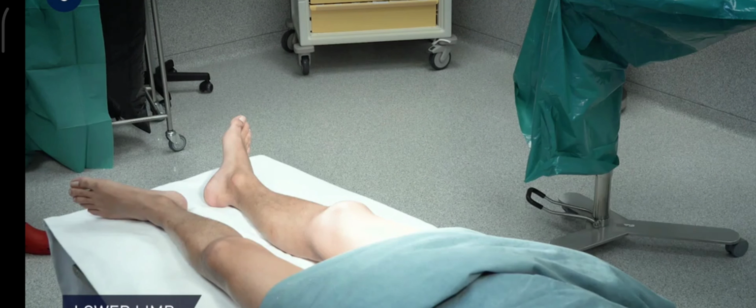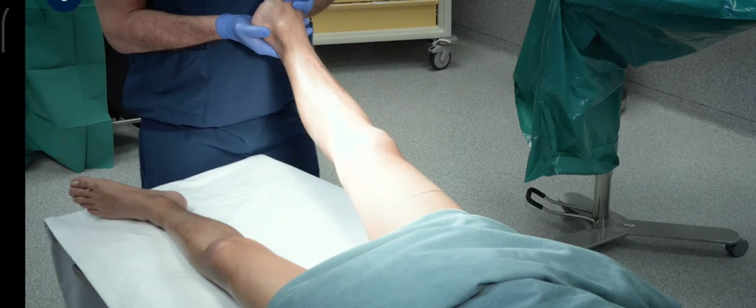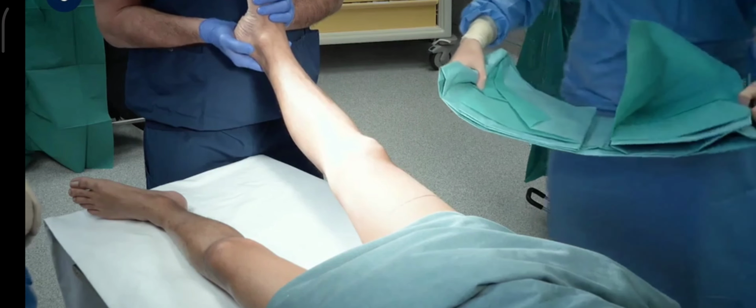Cleaning and draping of the lower limb typically requires 3 members of the OR team, 2 sterile and 1 unsterile. In this film, cleaning and draping is demonstrated for procedures around the knee. A stockinette and U-sheet will be used. The unsterile assistant holds the foot and lifts the lower limb.